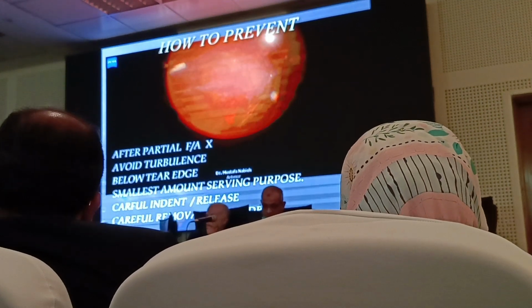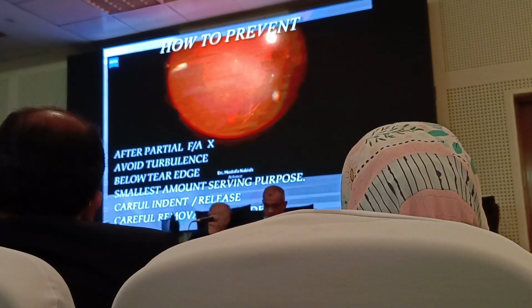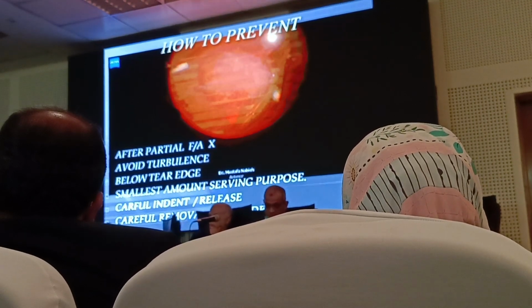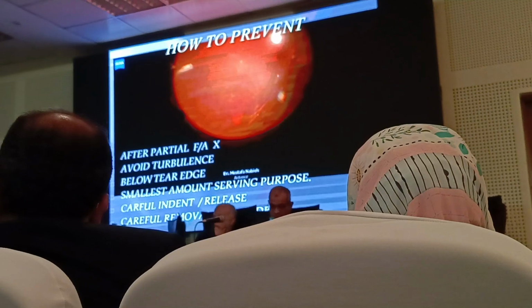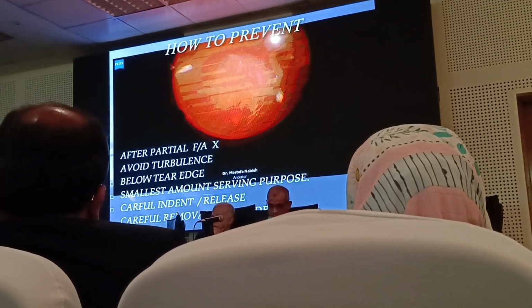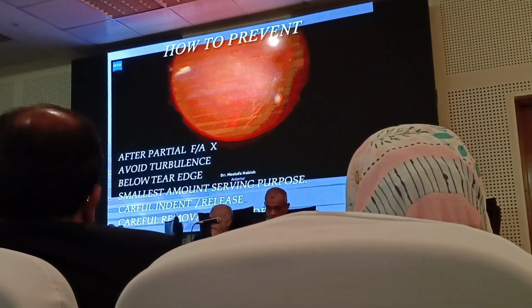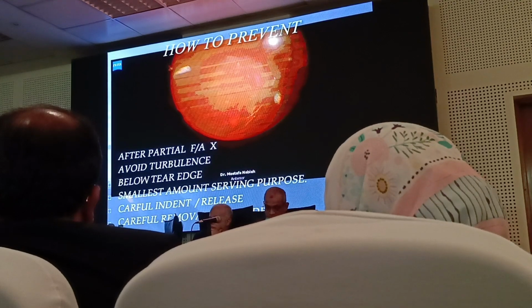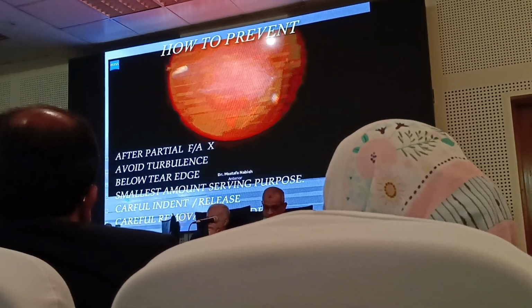Especially at this point, something else happens. When you release your indentation, there is a sudden hypotony that allows sudden egress of infusion fluid, inducing turbulence. So you induce bubbles and attract the bubbles to the subretinal space. So this movement should be very slow and very careful.